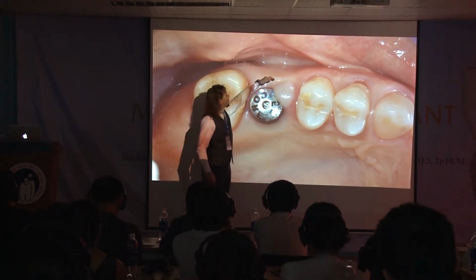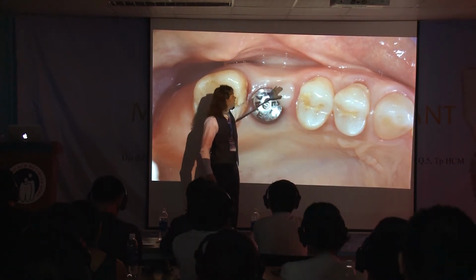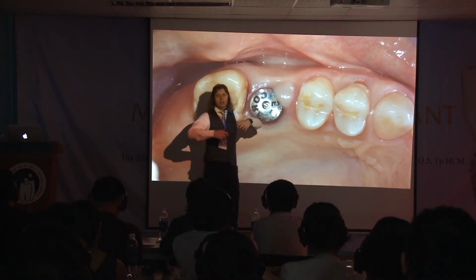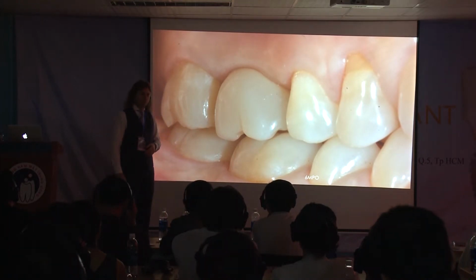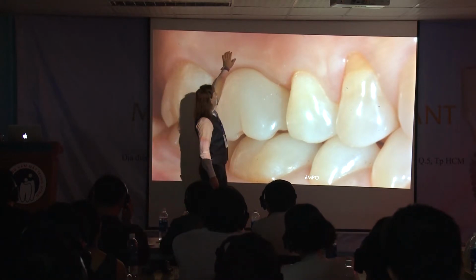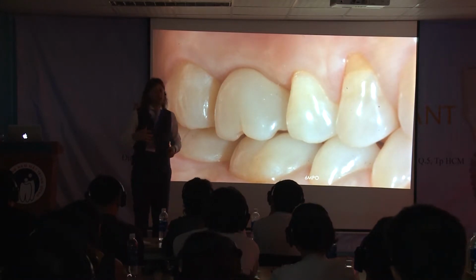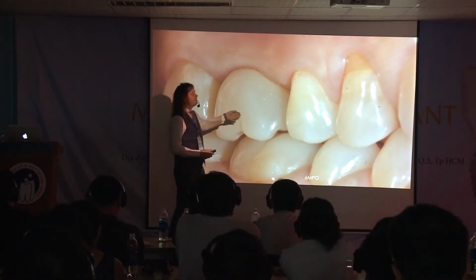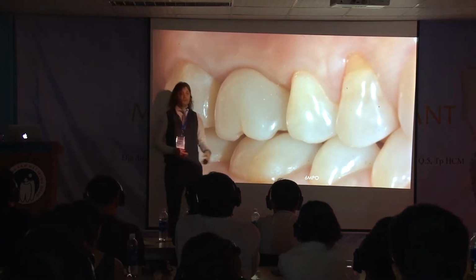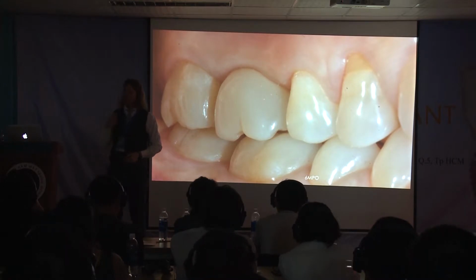There is a collapse. And here it begins growing. I want to use this volume to reduce the collapse with the provisional. I don't like collapsing here, because if you leave a minus of volume there, it's not a problem of aesthetics, but every time you eat, the food will stay there. And it's not good to have food staying just next to the implant the whole day if they don't brush.